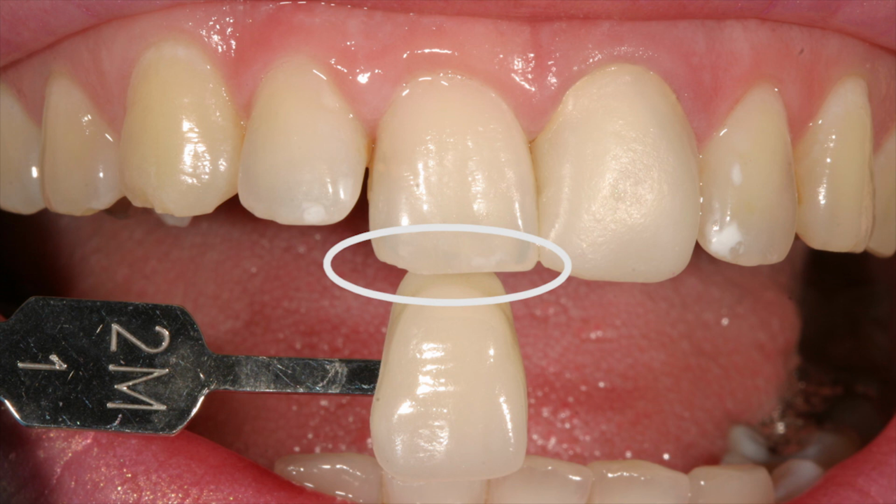That's why you want to be at the same profile, just barely below the incisal edge of the tooth, not up behind it. And also reference the incisal edge of the shade guide itself. The lower incisors are actually influencing the natural translucency of that. So you definitely wouldn't want to have that type of picture.